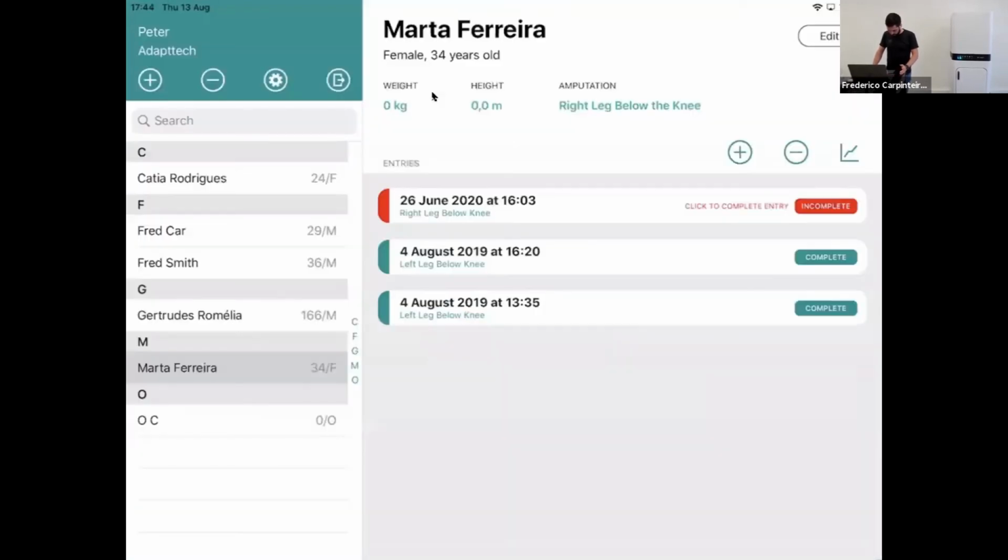Let's go back. So I think that's pretty much it. We've been through all the process. Then you can now remove the socket from the scanner, and if you want to move on to the acquisition, just get the wearable around the socket facing the outside, press it against the socket, and then you just connect the strips into each place, turn on the devices, and you're good to go. In this case, you would add a new analysis. I can show you that as well.